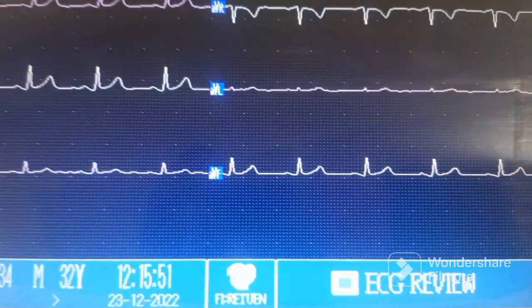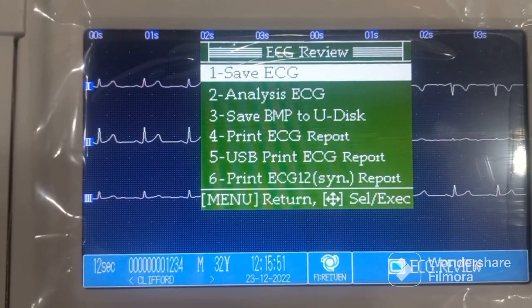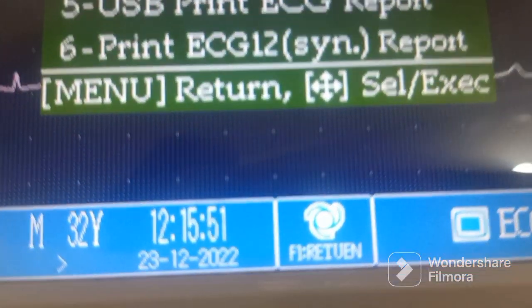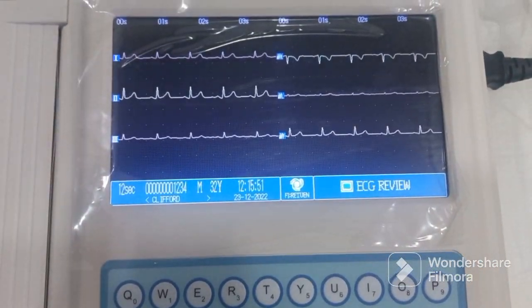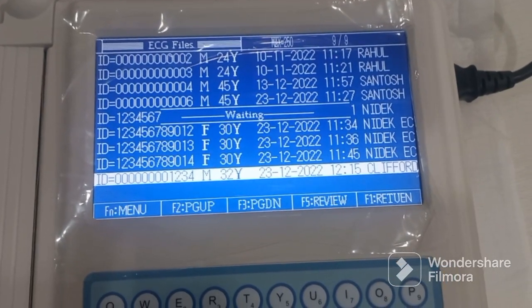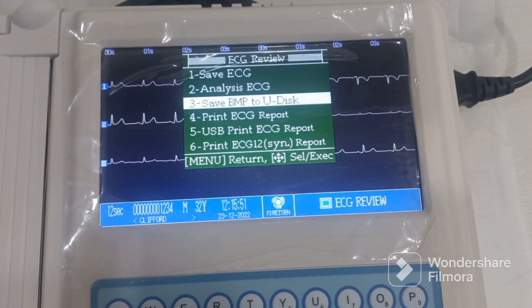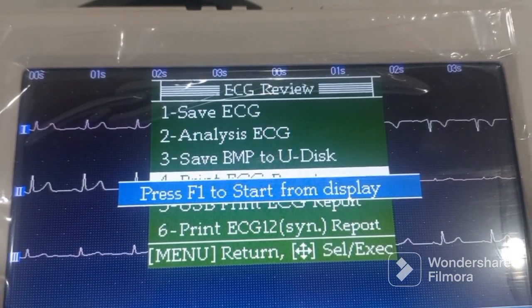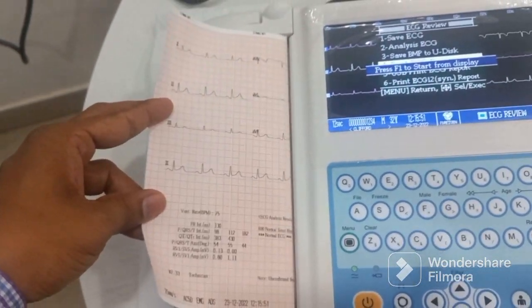If you want to review the saved ECG, press the menu button — you'll see a symbol on screen. Press it to get the menu options: save, view analysis, or print again. Press the F1 button to return to the previous menu. If you want to get a print again from the saved file, go to the review button, press the right button, and it says 'press F1 to start from display' — so press the F1 button and you will get the print of the previously saved ECG.